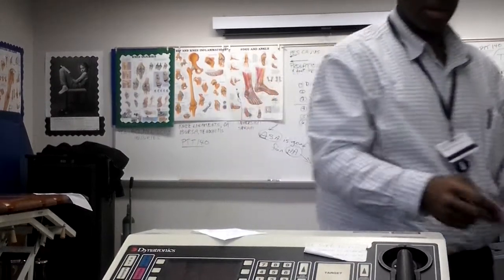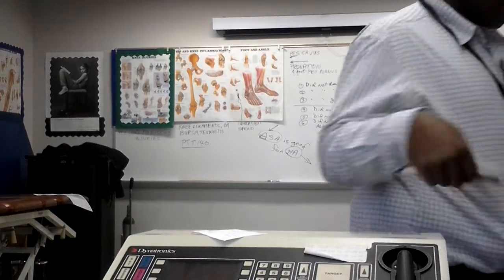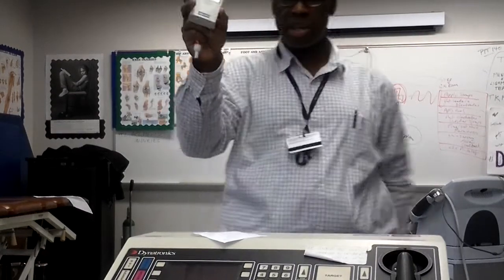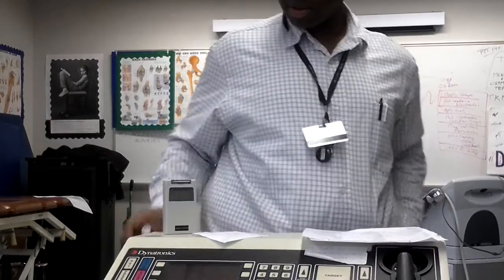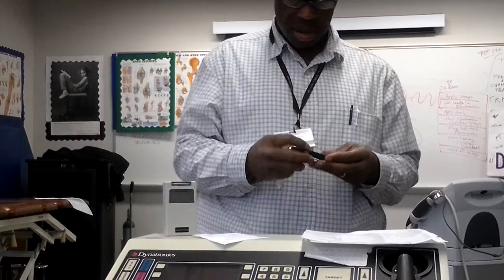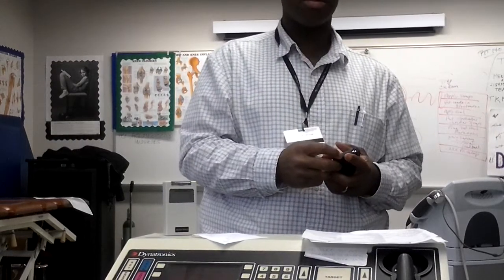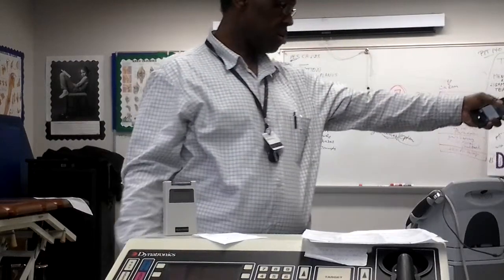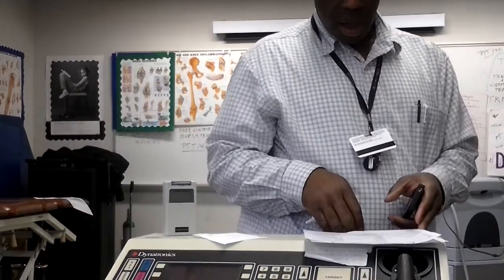All right, mode. Continuous. What does that mean? Constant tingling. What does it say on this machine that continuous means? Constant. Good. Anybody remember what it says on the stackable unit back here? It was for home assignment. Pulsed. All right. Good.